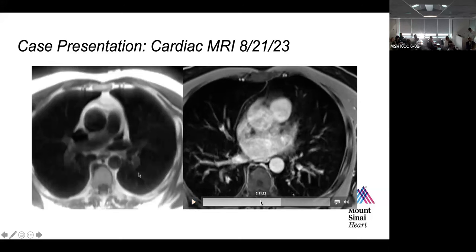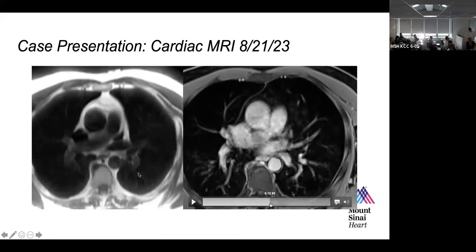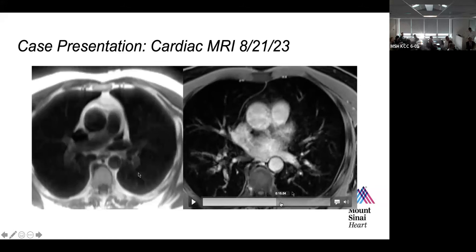If you can freeze it and please point with the pointer, right there. Yes, right there. Please show the pointer. So right there, there should be a wall, there should be a black line there, there's not, okay?